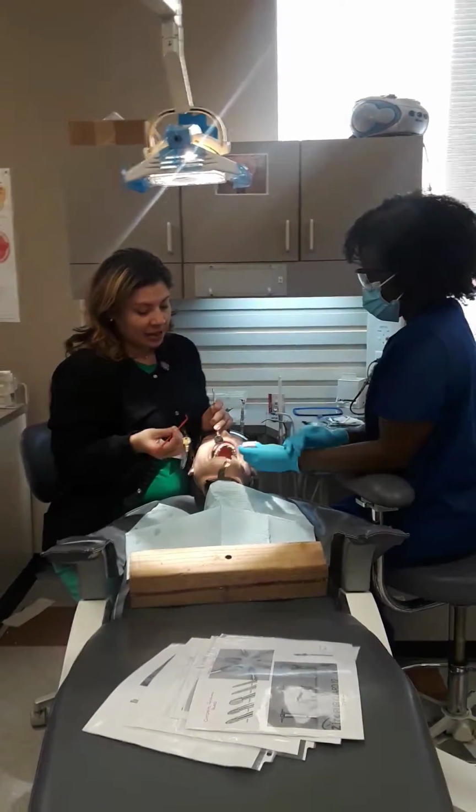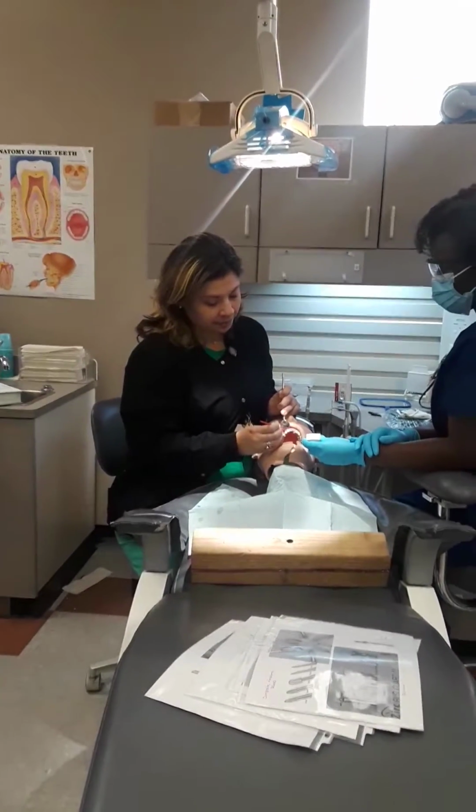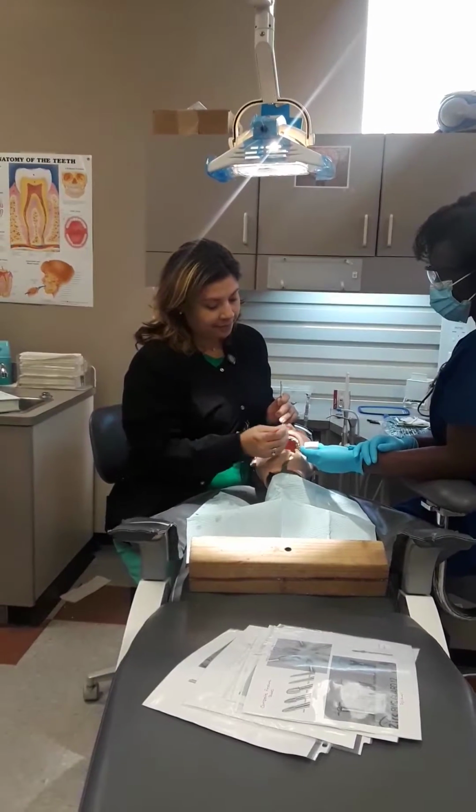Okay, bond, that's why we need it completely dry or somewhat dry. We're going to put bond on this time. And bond only goes in my prep.